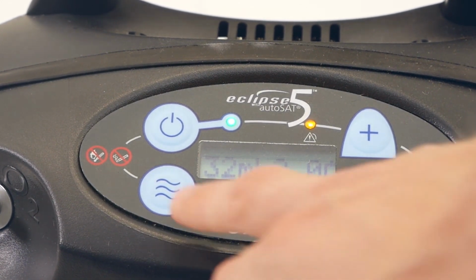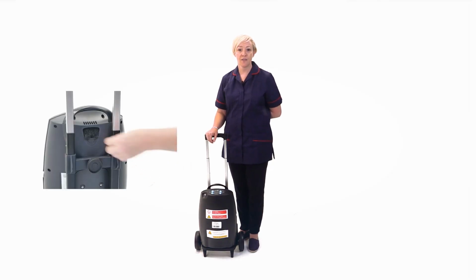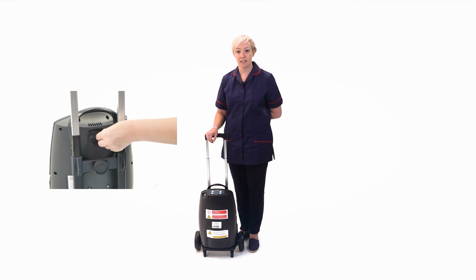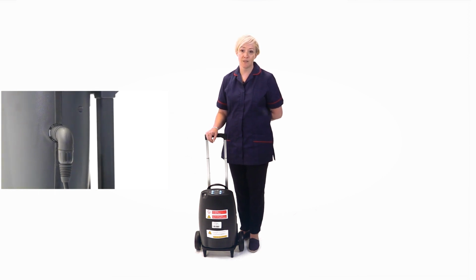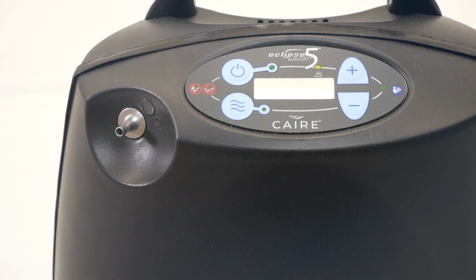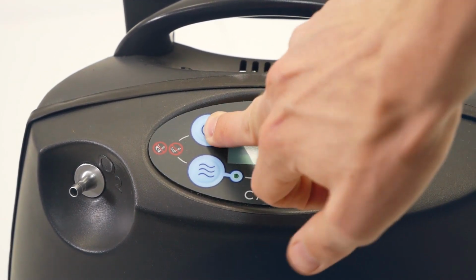To use your concentrator, place the device in a suitable location. Ensure that the air filter is installed in the cavity just below the handle at the rear of the device. Select the power source. If using AC power supply, then plug the cord into the device and wall outlet. If using DC power supply, plug the cord into the device, start the car before inserting into the DC power port. Connect your oxygen tubing to the outlet port, then press and hold the power button to turn the device on.